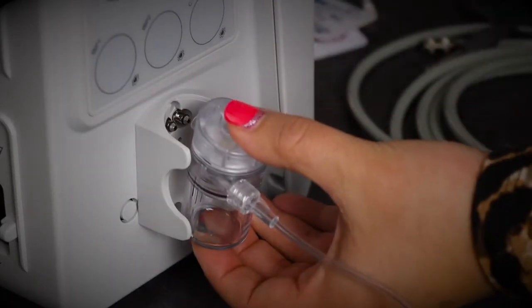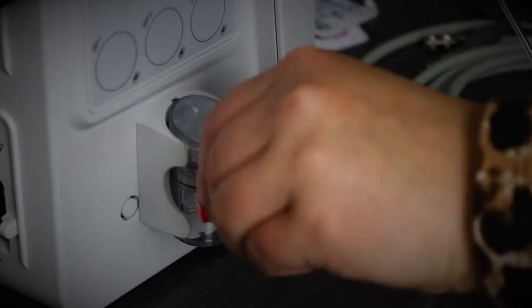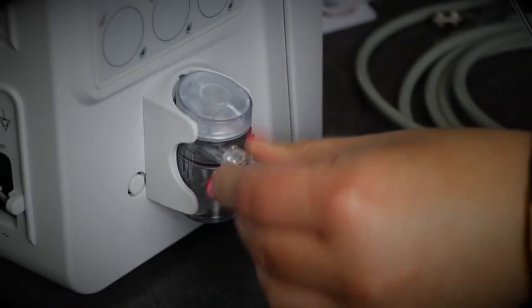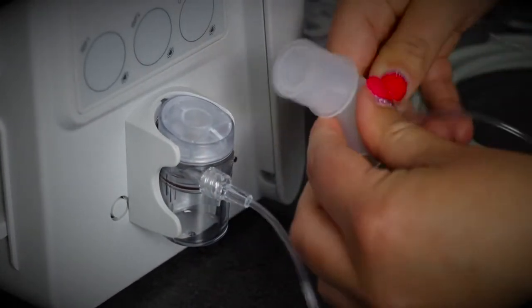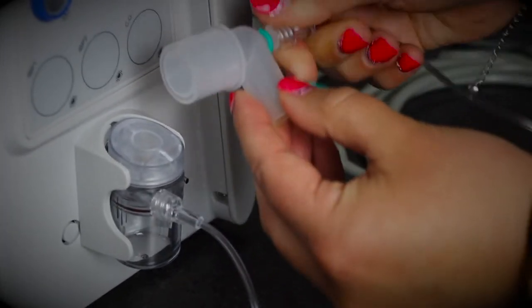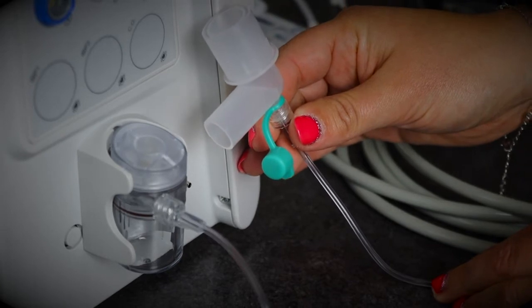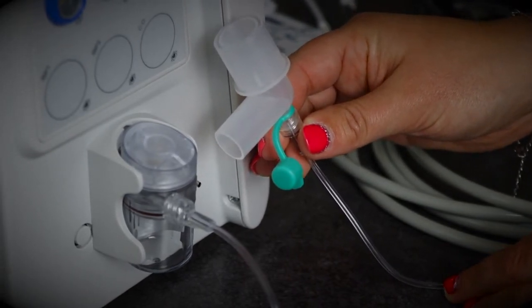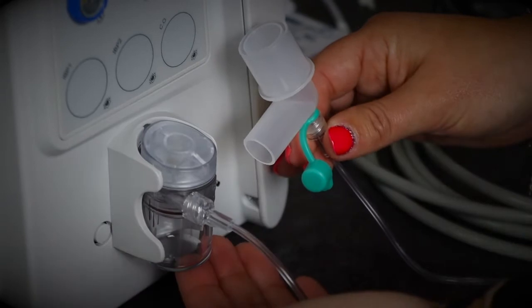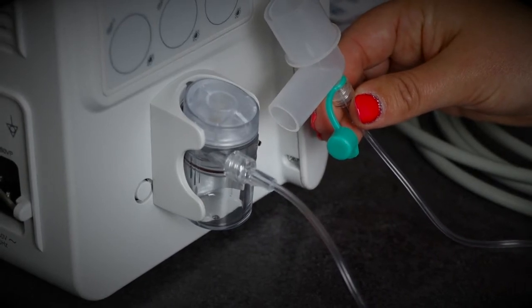This is the water trap and the sampling line for the capnograph. You'll see we have two holes here that correspond with the two holes in the machine — you pop it in there. This is a luer lock so it will lock on by a simple twist. The other end, also a luer lock, attaches to the elbow connector that connects to your patient. The water trap and sampling line needs to be changed every four weeks or every 100 hours of surgery, whichever comes first, because moisture builds up and this ensures accurate capnograph results.